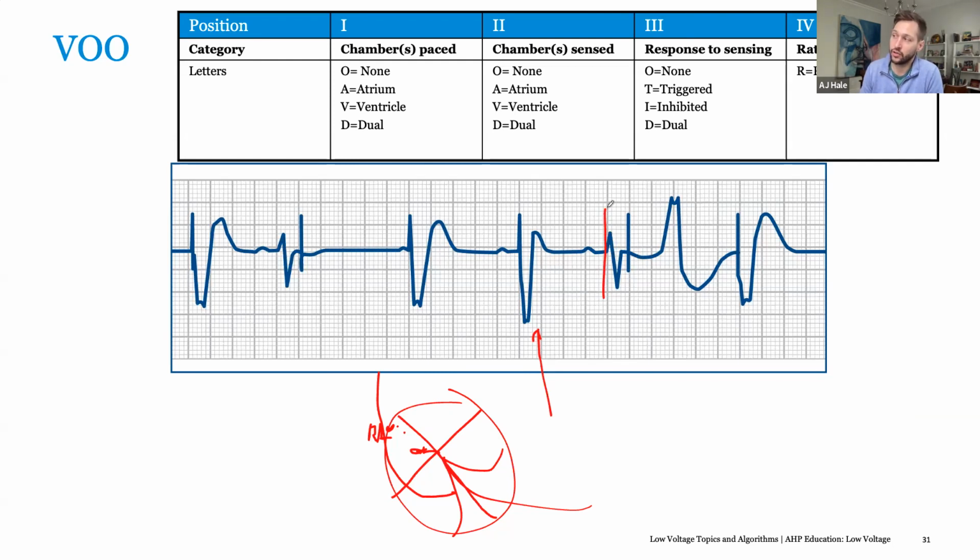So there's no contribution of the pacing to the actual cardiac activity or to the EKG, to the electrical function of the heart. Versus a fusion, you have your pacing spike occur, and you have the contribution of the intrinsic conduction that will affect the way the entire electrical impulse travels throughout the heart.